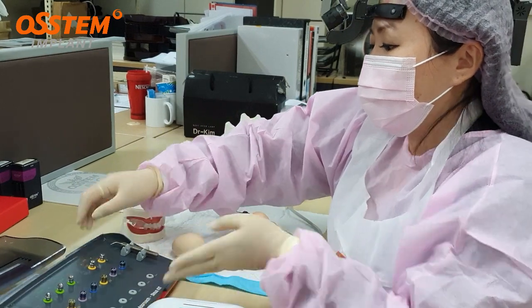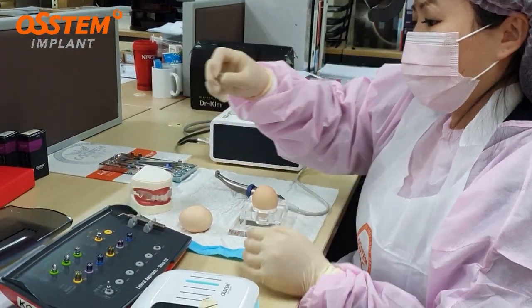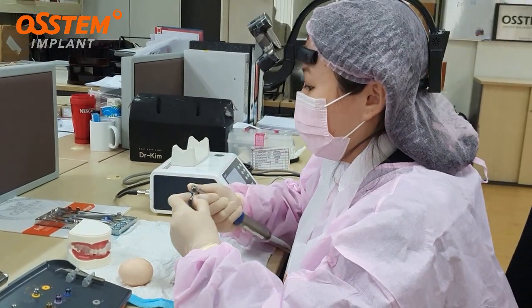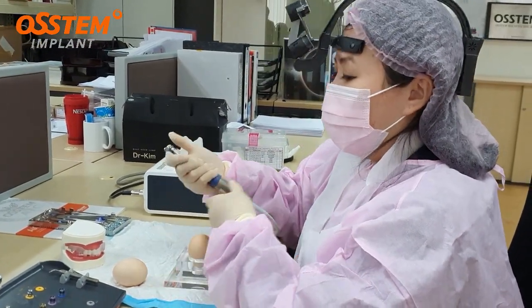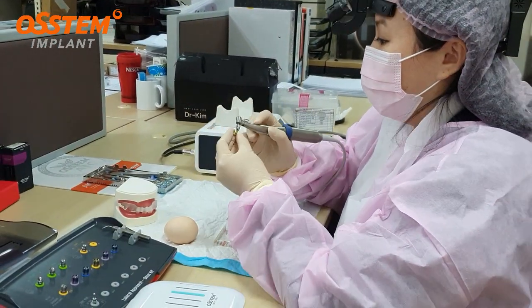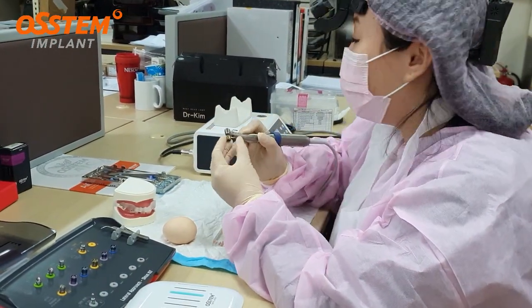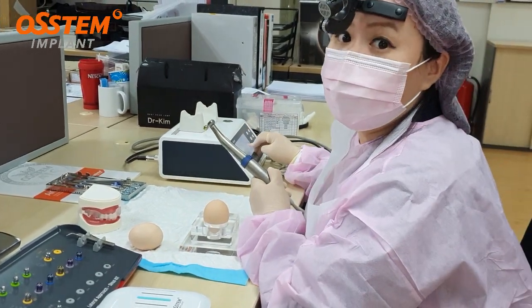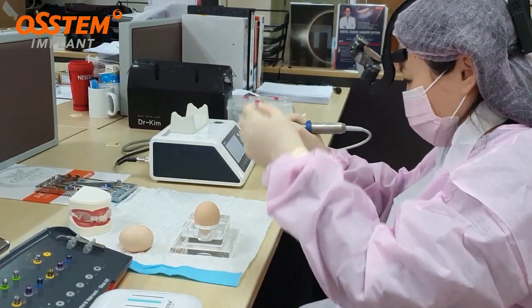Today I'm going to start with the core drill. This is how we place it inside the handpiece. I'm going to put a stopper of 0.5 into it. The speed for my motor is 1,200. So I'm going to do it.